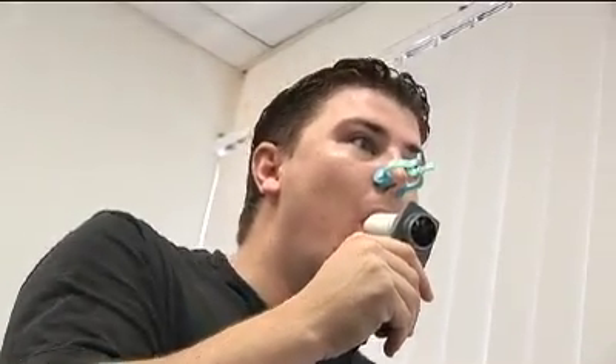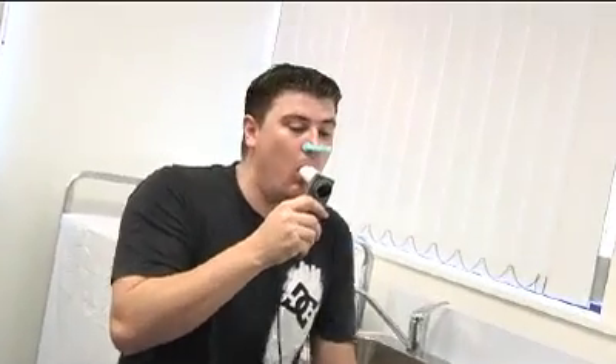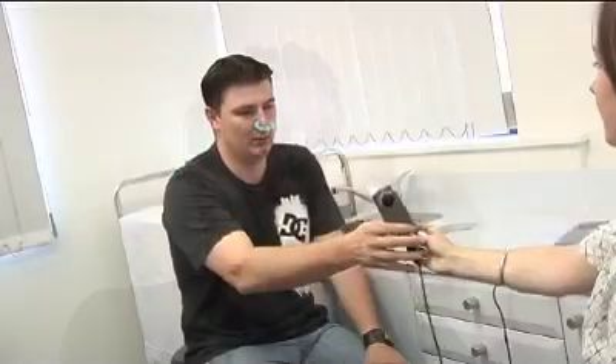In addition to that, any vocalisation, putting your tongue in the mouthpiece, or coughing during the manoeuvre will lead to erroneous results. Another very common problem is trying to blow into the mouthpiece like a trumpet with your lips pursed and your teeth closed.